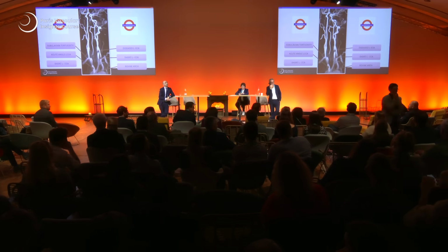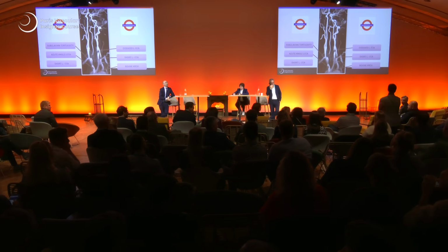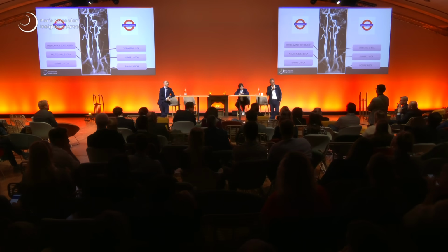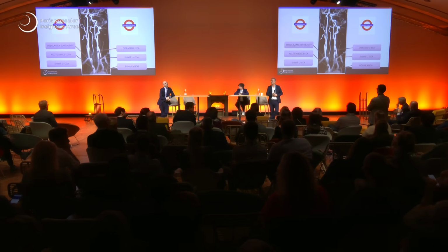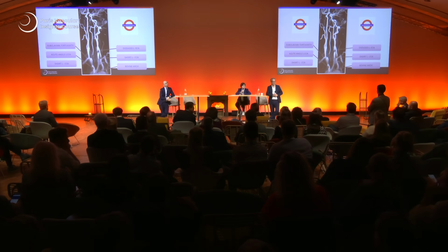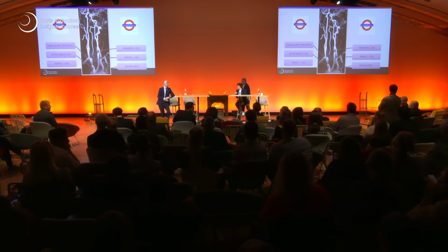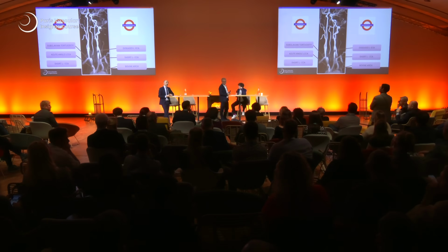Okay. Actually, if I see a picture like this, my first idea is to go from radial. That's because in an anatomy like this, with the internal mammary artery catheter, I think that we usually go in the external with the supportive wire, and then we try to go maybe with the 5 French destination, and to follow with a Roadsaver or a small carotid stent. I think it's really good to discuss this. Your experience is important to make the decision.